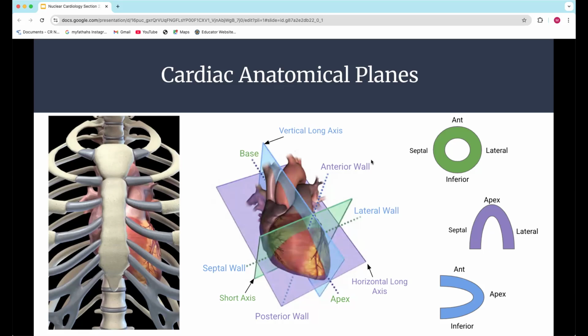So this one is like if I took that first donut, right? We put that donut up, and then we just flipped it sideways, okay? So here's the anterior part of our donut if we have a circle, and we're just flipping it this way. So anterior is still anterior, inferior is still inferior, and now our apex is over on the right side of the image there, okay? So this took me a minute when I was a student to get like, what in the heck am I looking at, okay? So look at this, study it out.